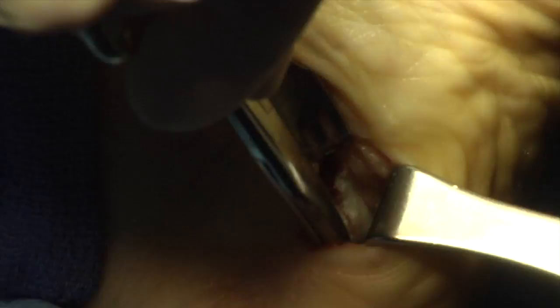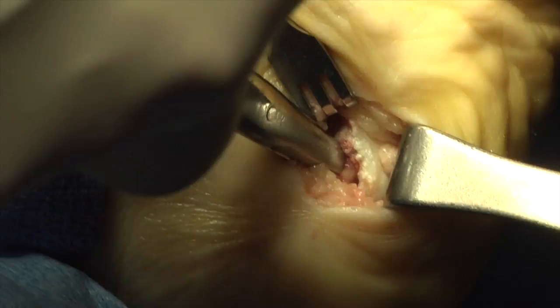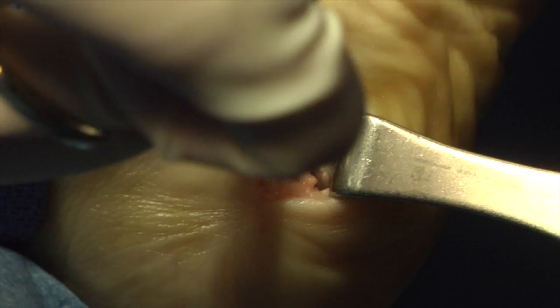As you can see, all the soft tissue has now been stripped away from the insertion of the plantar fascia, where it inserts in the bottom of the calcaneus. This is the heel bone or calcaneus right here, and we started a small nip in that area. You can see with the scissors, right between that and the muscle belly, you can actually release it.